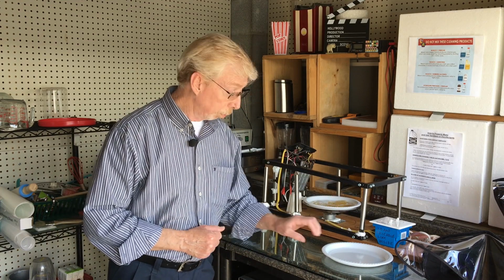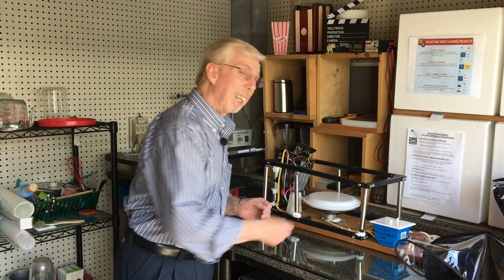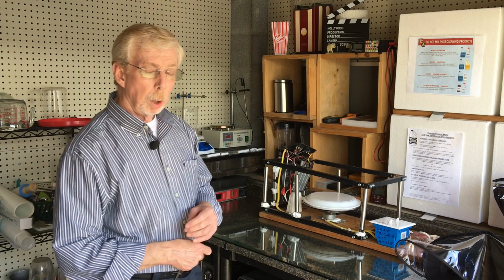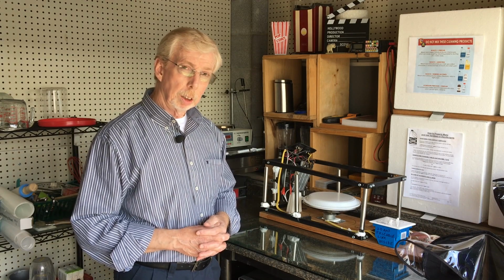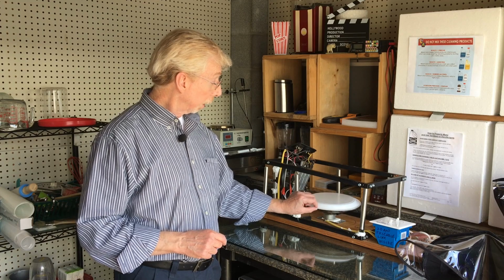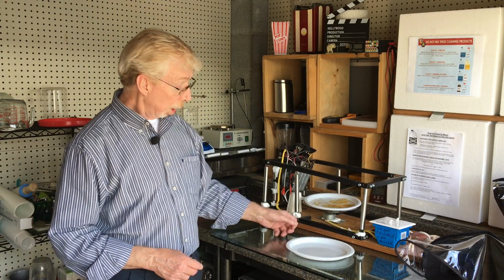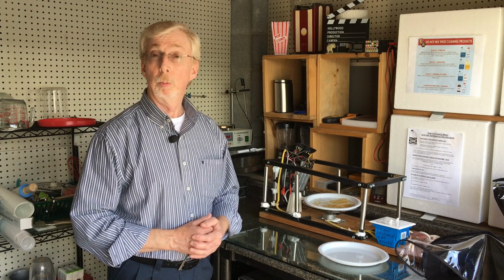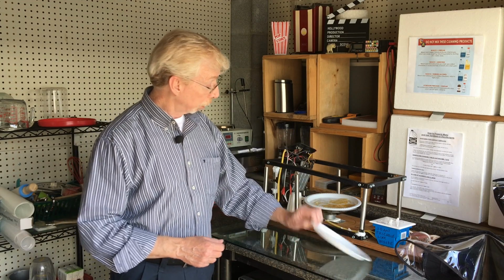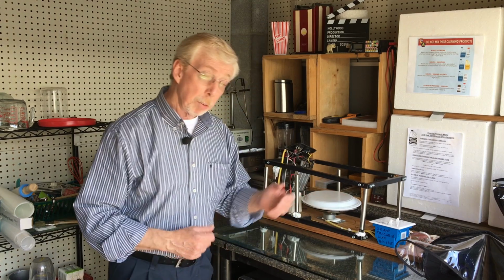Pour the new sample. It's just a light covering to keep out dust. Now, as you saw, the size of this plate is not as big as this. So what I'm going to do is make several and stack them up. As you can see, these plates will stack. They're not very heavy, lightweight, and I'm going to let it stir for a couple of days.